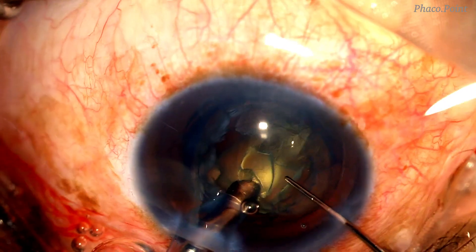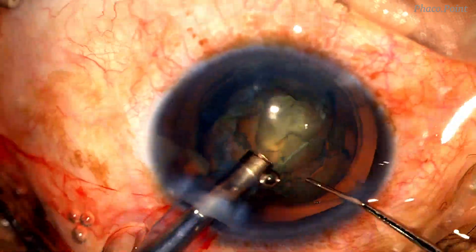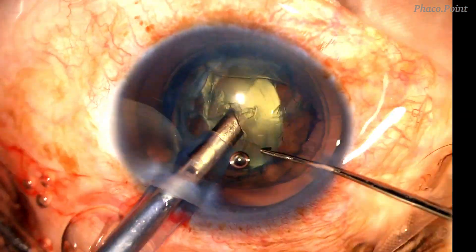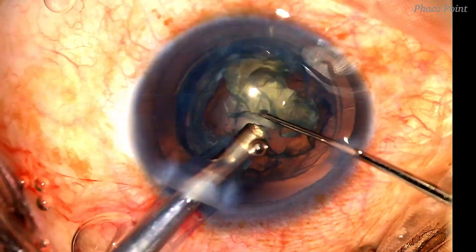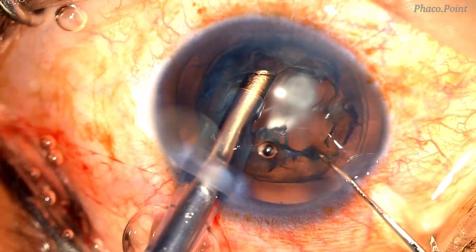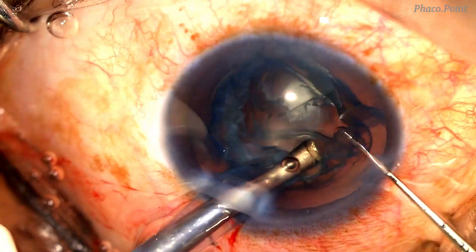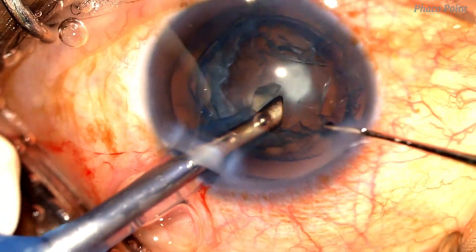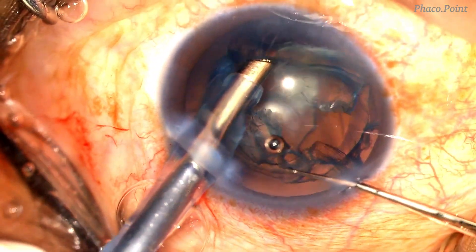Watch how the phaco probe now holds onto the nucleus and, in aspiration mode only, elevates it out of the capsular bag and aspirates it in the pupillary plane. With extreme care and caution, I now try to separate the epinucleus from the equatorial plane in the epinucleus mode of phaco emulsification and attempt to aspirate it.